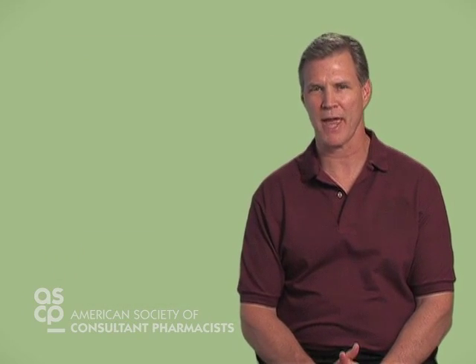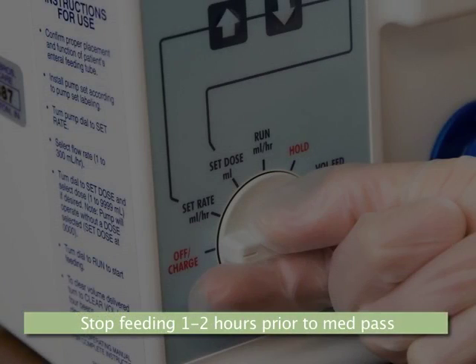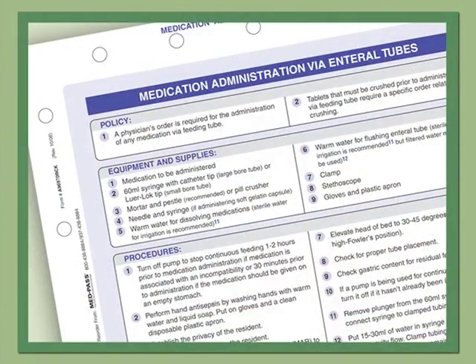Watch as the nurse prepares Mr. Hansen for the procedure. If the resident is receiving enteral feeding around the clock, or just prior to the med pass, and one or more of the medications is incompatible with enteral feeding, or needs to be administered on an empty stomach, remember to pause or turn off the enteral feeding pump 1 to 2 hours prior to medication administration. Use a reference to look up enteral feeding interactions or incompatibilities prior to administering any new medication via the G-tube.